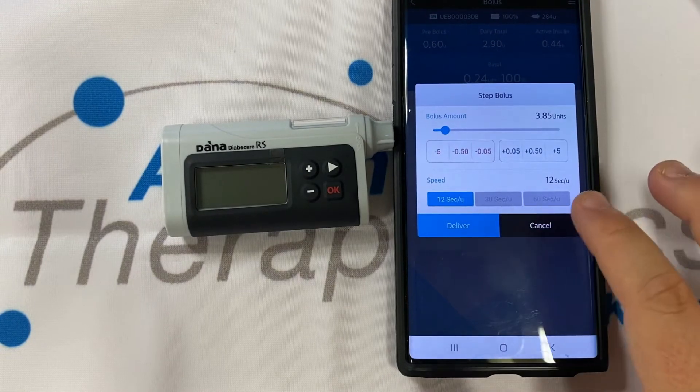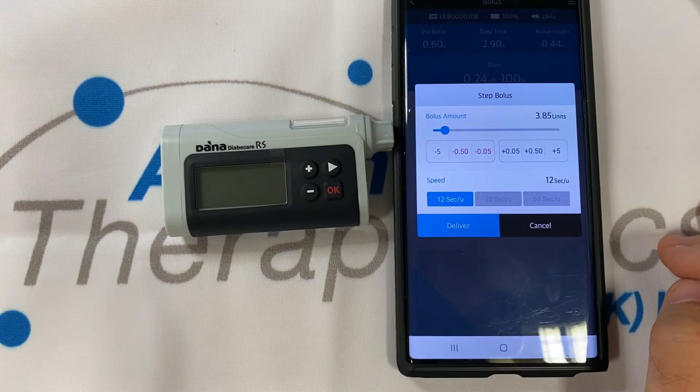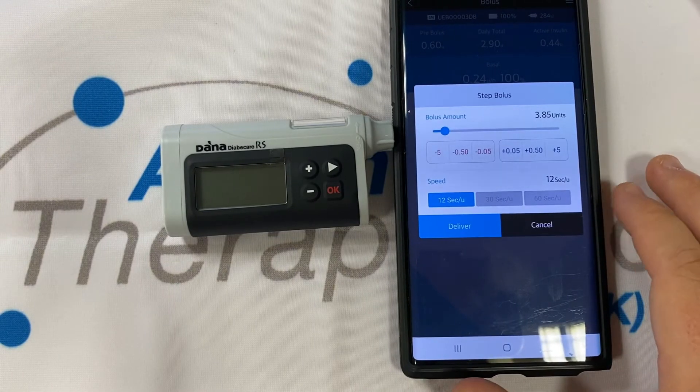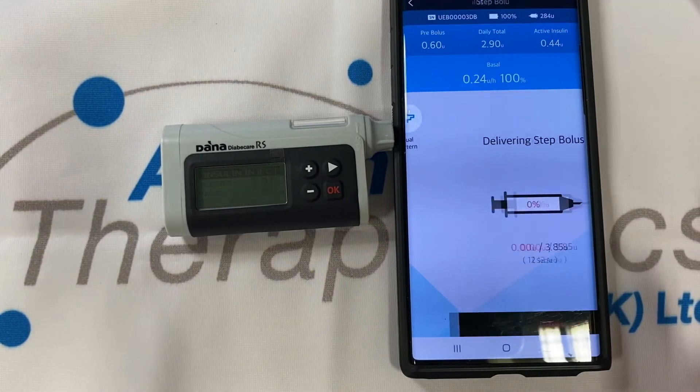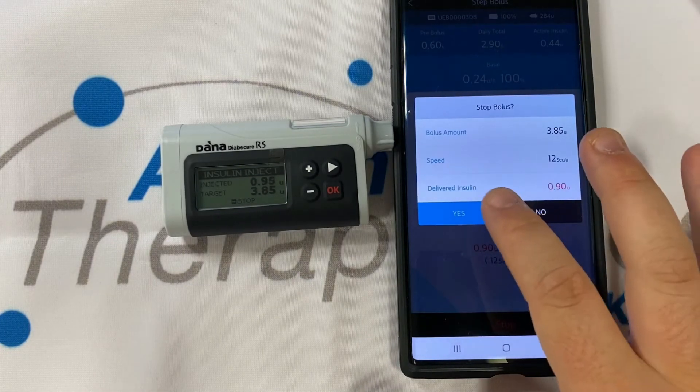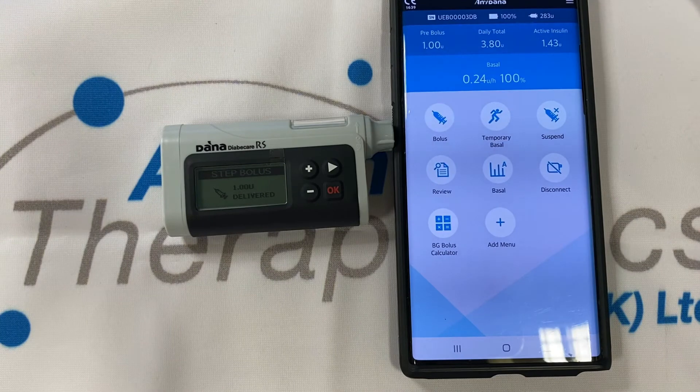We may also vary the speed of delivery for an instant bolus, and we can override the bolus amount. Delivery is instantaneous and the pump will respond in kind. The pump has a language of vibration so you'll know when it's responding to you without having to check. You can always stop the delivery and the pump will listen straight away.